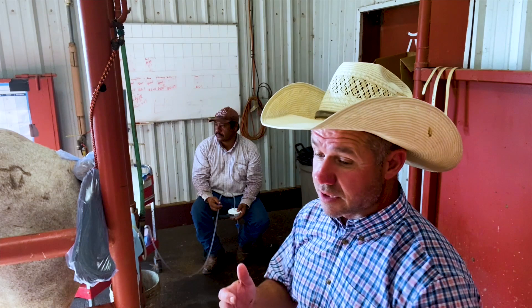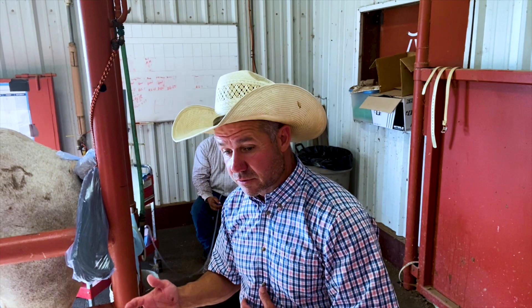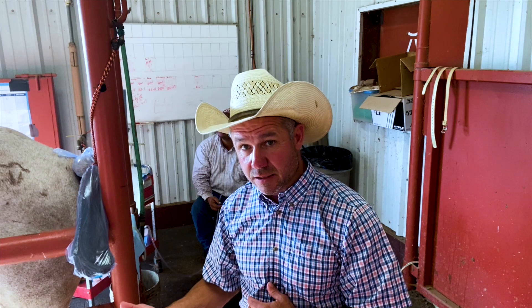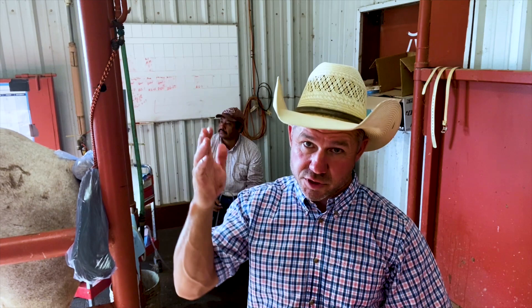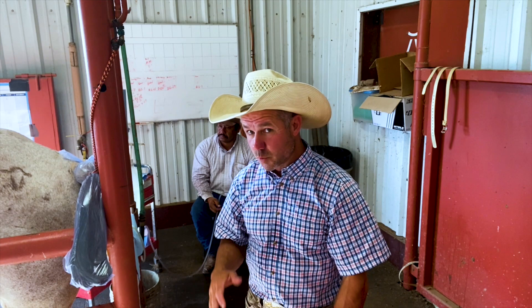Essentially how it works: she comes into heat, we order semen on Thursday, I give her a shot to make her ovulate on Friday night, we get the semen in on Friday morning and we breed her. She ovulates Friday night, Saturday morning. We checked her Saturday morning, she'd ovulated, so we wait a week. In between, we set up a recipient mare — that's just a quality mare that's going nicely, so we repurpose her to carry the embryo as the surrogate. We had the recipient ovulate on Monday, so she ovulated about a day and a half behind the donor. I like the recipient to ovulate a couple of days after the donor.